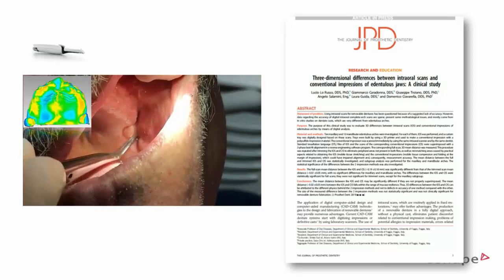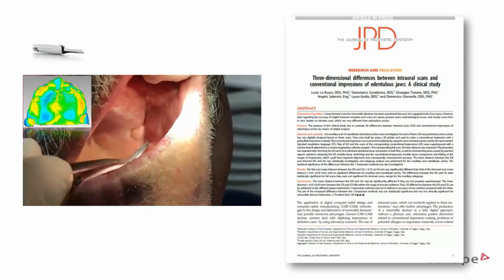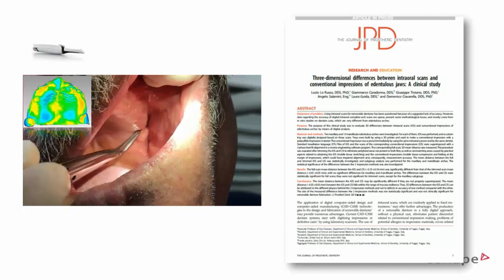I don't know if that was actually completely clear. Do you want to add anything for that, Rune? No, I mean, some of them are actually skipping the try-in phase, and when we have some slides on the workflows, we can touch upon that. But no, he's not doing any functional impression using the try-in itself.